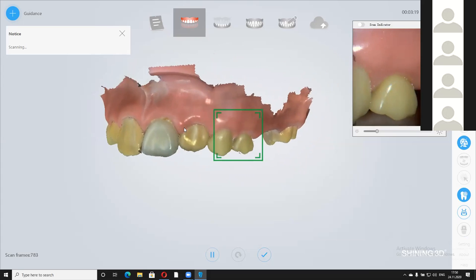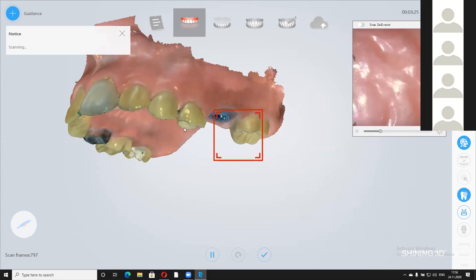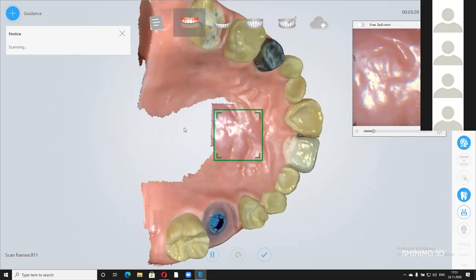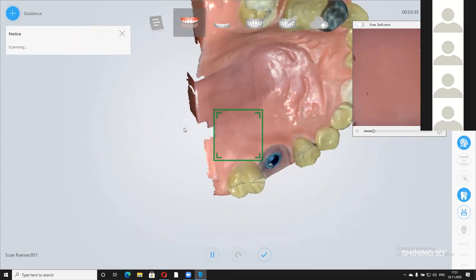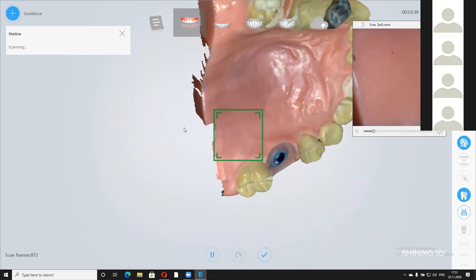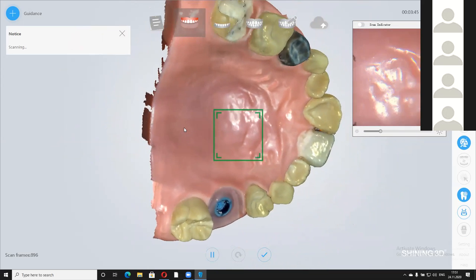And all this debris which is showing up disappears, huh? Have you done the whole jaw at the back? Yeah, I think everything has happened, huh? Here, to give you an idea, this is a shiny surface. And this was what was amazing for them in the hospital for the small kids. They said this is perfect when they have to do pre-operation models and those kind of things. Keep in mind, this model is really shining, huh?